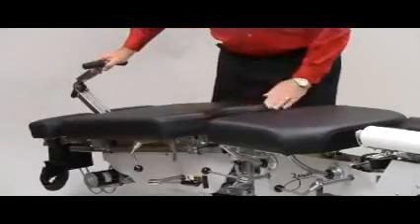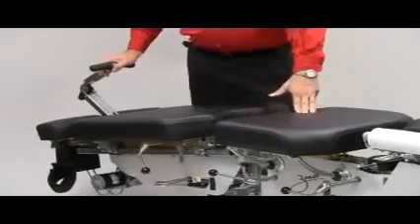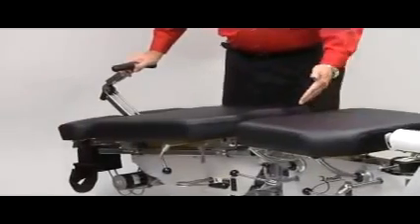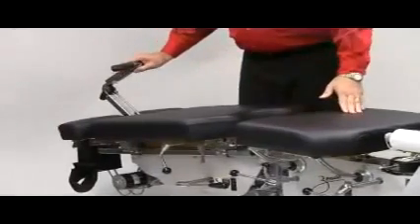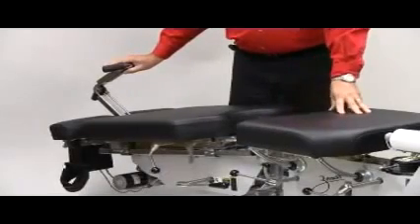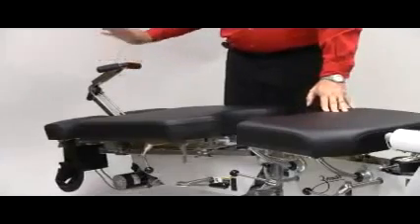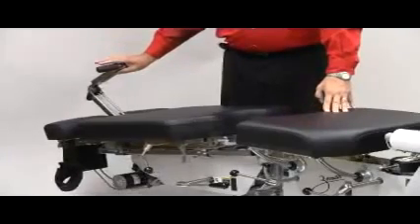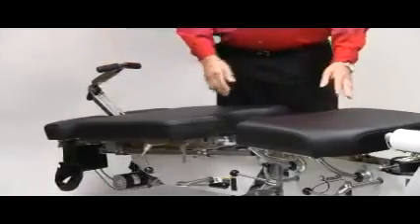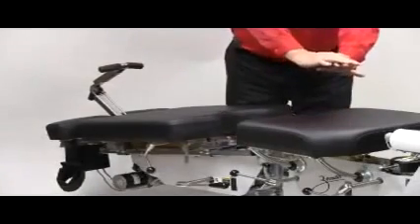The next feature we'll discuss is the automatic axial distraction system, which is great for decompression therapy. The table is on and ready for treatment. It allows for a total of 10 inches of treatment, automatic, and all I'm doing, doctors, is pulsing the button. I also have available a foot switch on the floor that I can use to treat full spine due to the foramen magnum pump.